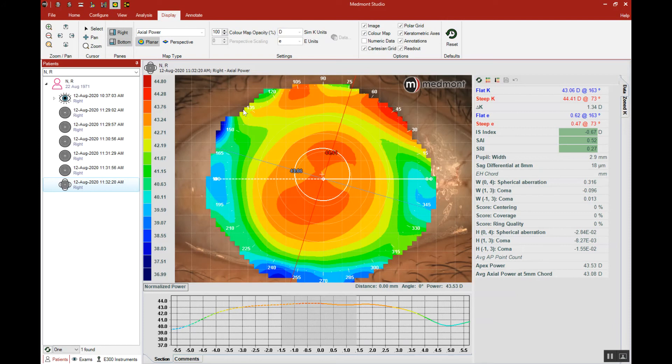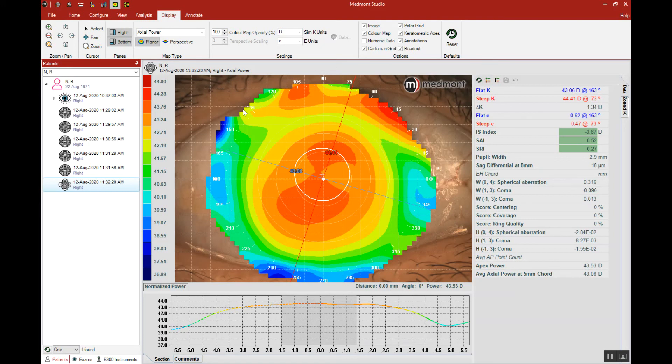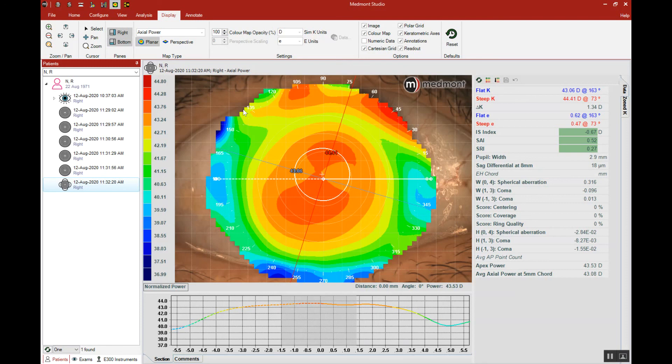Now if we were fitting a large diameter corneal GP or scleral lens, that peripheral data is going to be very important in the accurate construction of the initial lens, especially if we're using the Medmont contact lens software. So this composite function is an incredibly valuable tool when you're trying to understand not just the central cornea and the mid peripheral cornea but the very peripheral cornea close to the limbus. It's valuable when you're trying to construct an initial specialty contact lens like a large diameter ortho K lens or a scleral. So use this function whenever you're about to design a specialty lens for a patient.